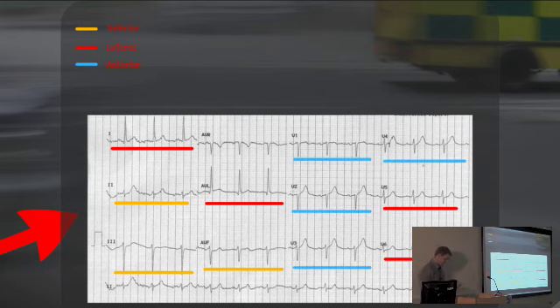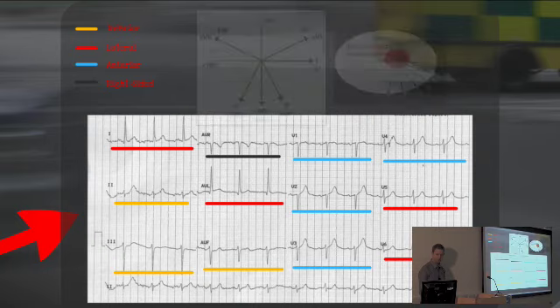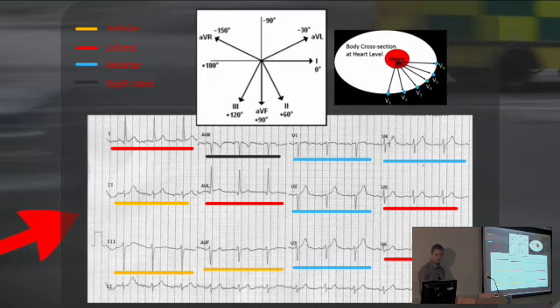Your anterior leads are obviously the chest leads that are where you've stuck the labels at the front, V1 to 4. And your right-sided leads, well, you've only really got AVR. V1 is just looking slightly to the right of the midline, and AVR is looking upwards as well. So if you really want right-sided leads, you've got to add those extra leads in. And there's the diagram, just as a reminder.